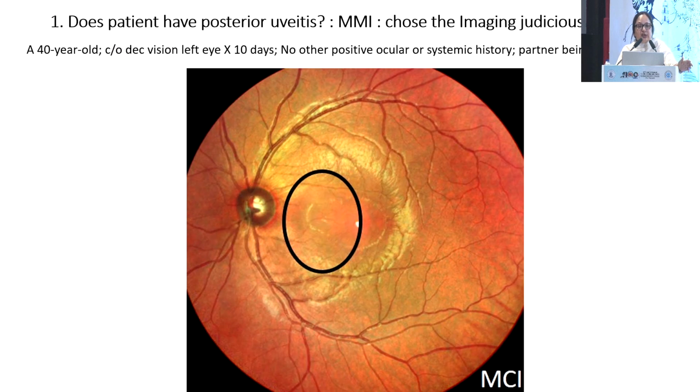Now, choosing the right imaging modality is very important. We generally look at our retina colleagues, and whatever our retina people tell us, we start following it blindly without even understanding whether that will be applicable in the context of uveitis or not. Now, here is a picture. Multimodal imaging, we do have pseudo-color. Now, Heidelberg doesn't even have the true colors.